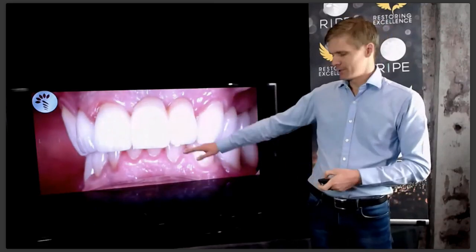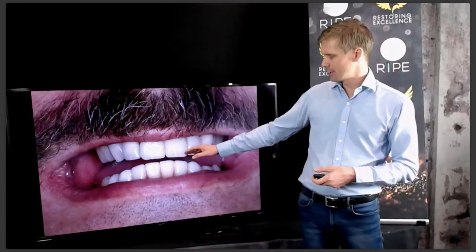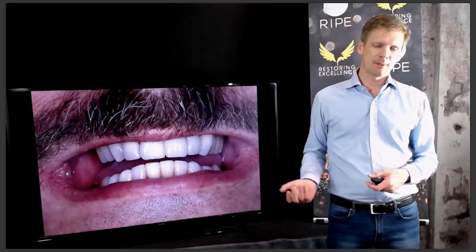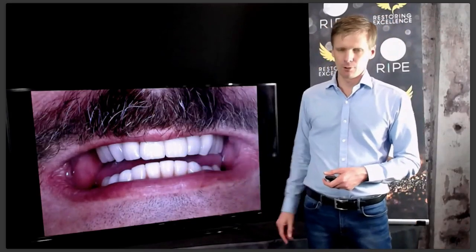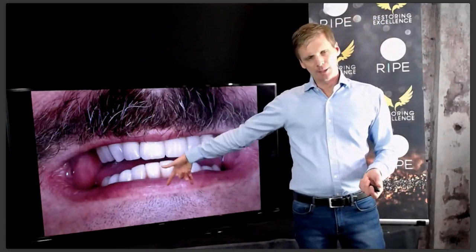Once again, seeing the overjet from here. Aesthetically, it looks pretty good now. We've lengthened the teeth. So it looks as good as we're going to get. The lower teeth display is probably still more than I would like, but he's posturing there. Short of cutting them all off and doing root canal therapy and crown lengthening, or extracting the 4 lower teeth and doing implants, there's no way that I could get them down.